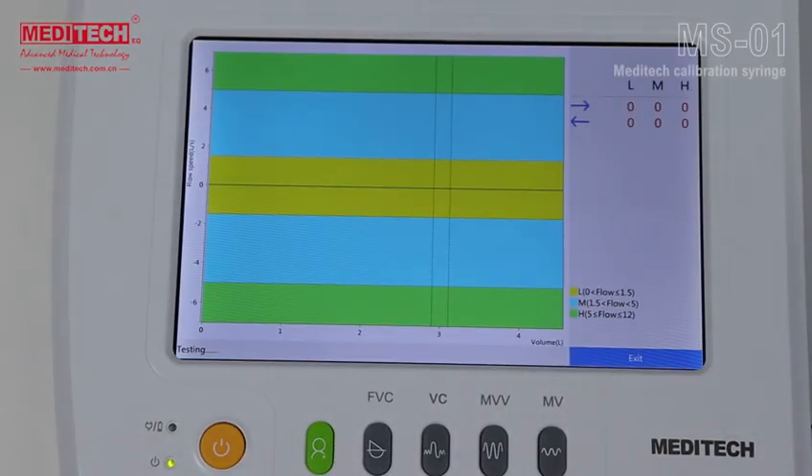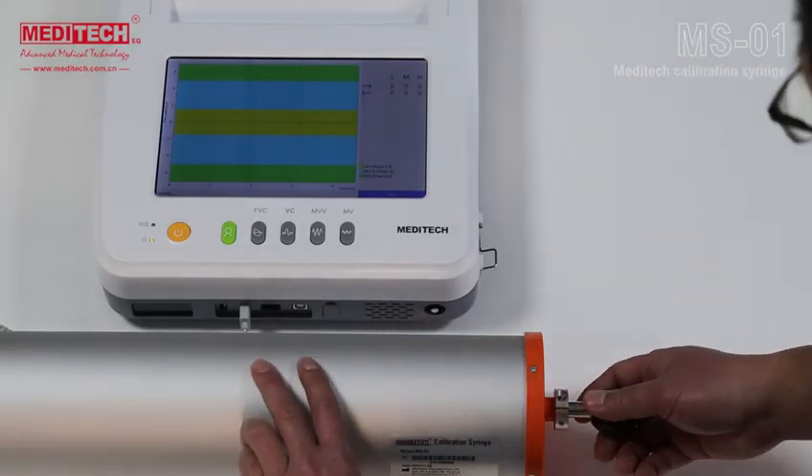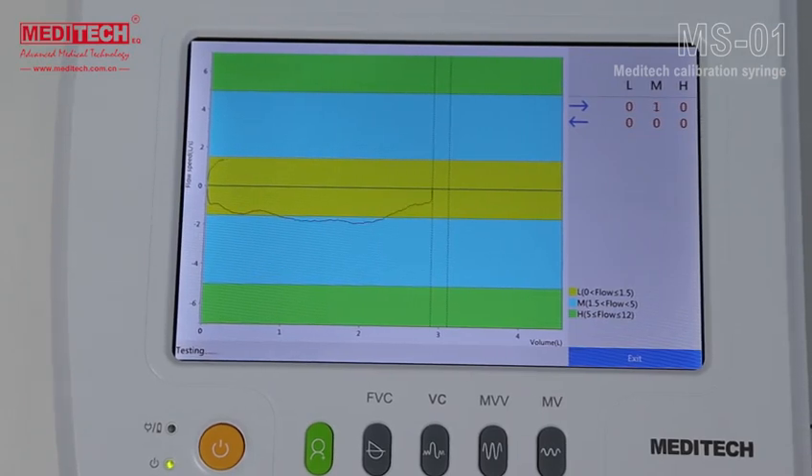Since this spirometer has an automatic zero initialization function, the subtitle 'Zero Initialization' will appear. When the subtitle disappears, you can perform the push-pull process at three different speeds: the first is slow, the second is medium fast, and the last is fast.